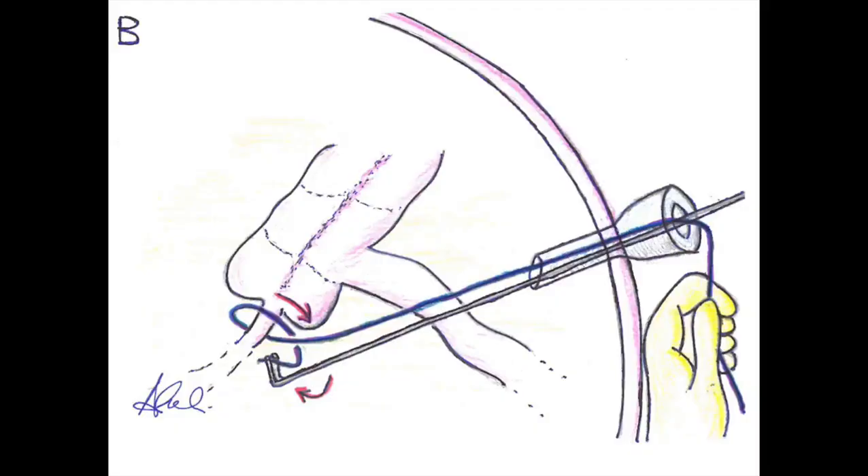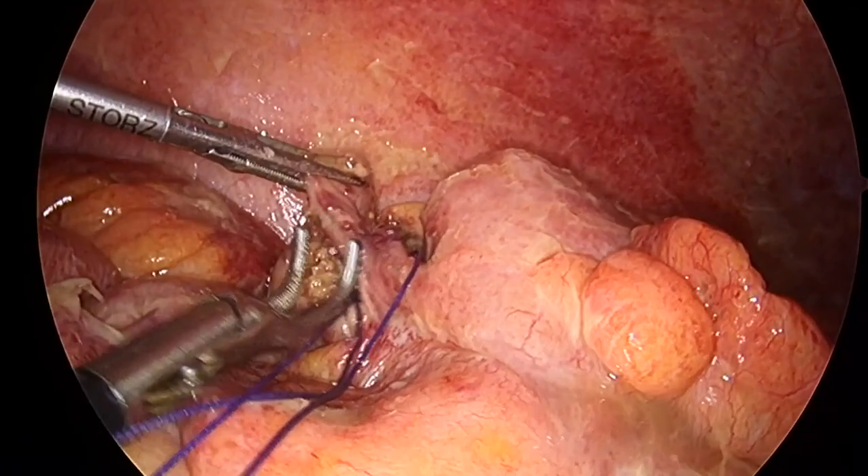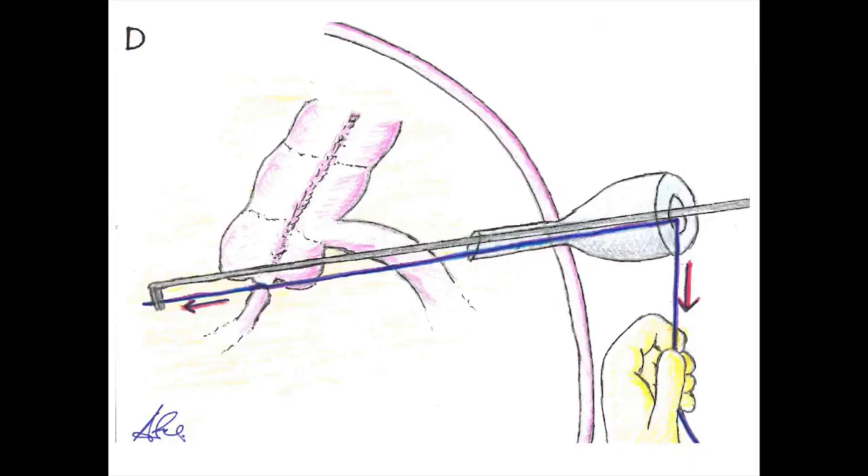To avoid this, if the base is viable, it is best to first dissect the avascular plane between the appendicular base and the meso-appendix. Pass it with the right-angle forceps or a Maryland dissector and tie a braided suture with an intracorporeal knot.